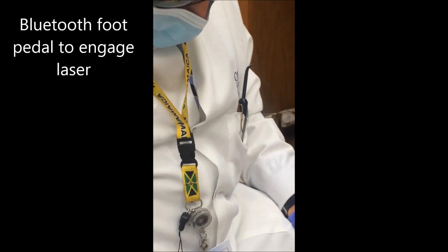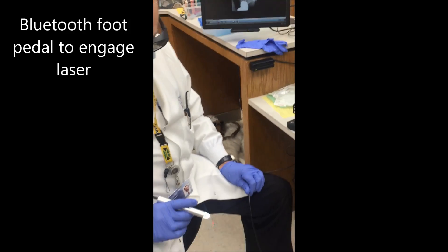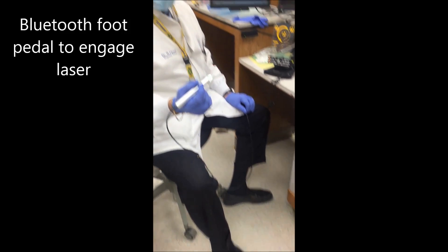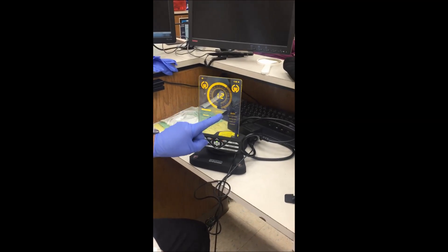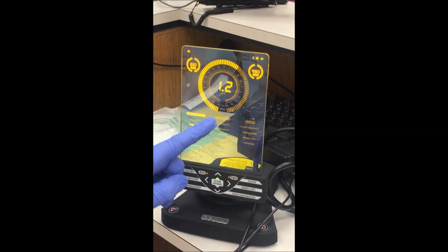We have a Bluetooth on/off switch, which is pretty handy. We can also change the wattage — this is a maximum 2-watt laser and we're going to go up to 2 watts today.